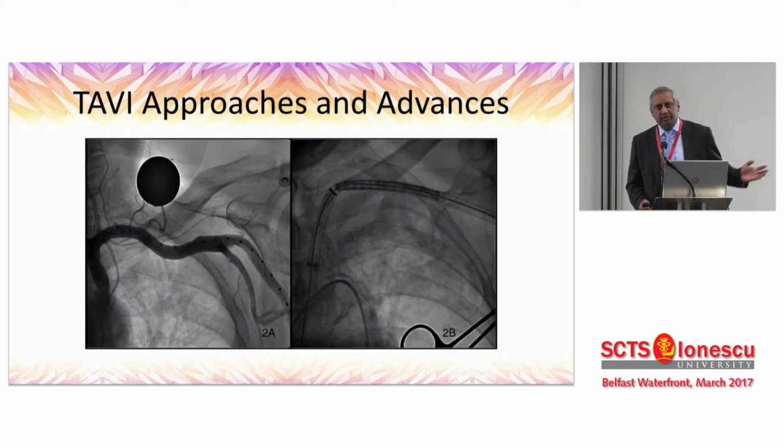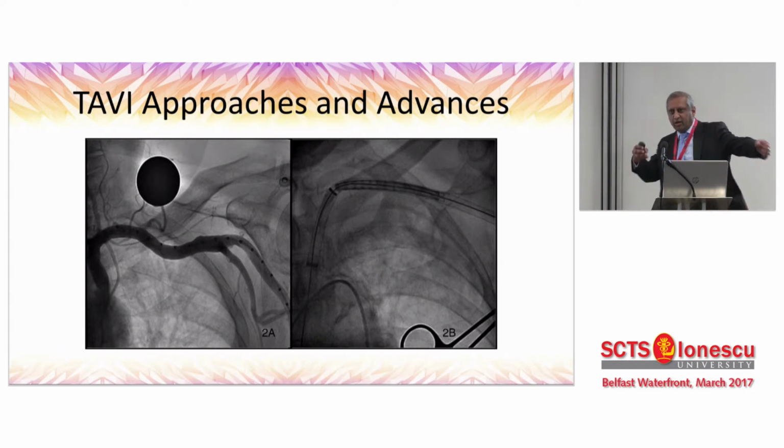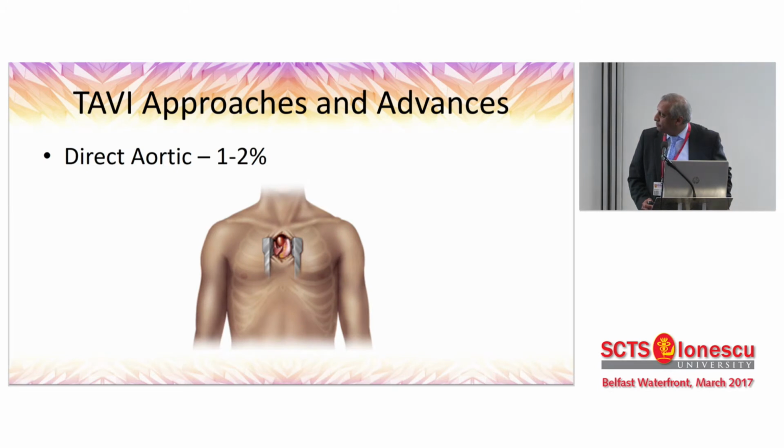The one thing I would say though is most of our TAVI delivery systems are devised to be used transfemorally. So you end up with this really long snake that you have to have 3 people behind you holding the device so that you can actually keep it sterile and deliver it properly.